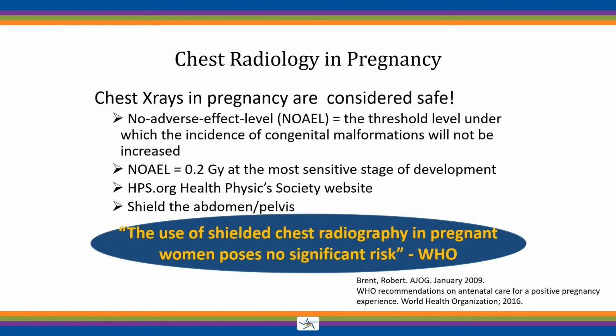Then we do recommend, in order to decrease the risk further, that we shield the abdomen and pelvis in any woman of childbearing age. Again, pre-implantation, we don't know that we actually are pregnant. So multiple places have cited the safety of chest radiography. I've listed a couple there on the bottom. Ultimately, the WHO has said that the use of shielded chest radiography in pregnant women poses no significant risk and does recommend its use in evaluating pregnant women at risk for TB disease.